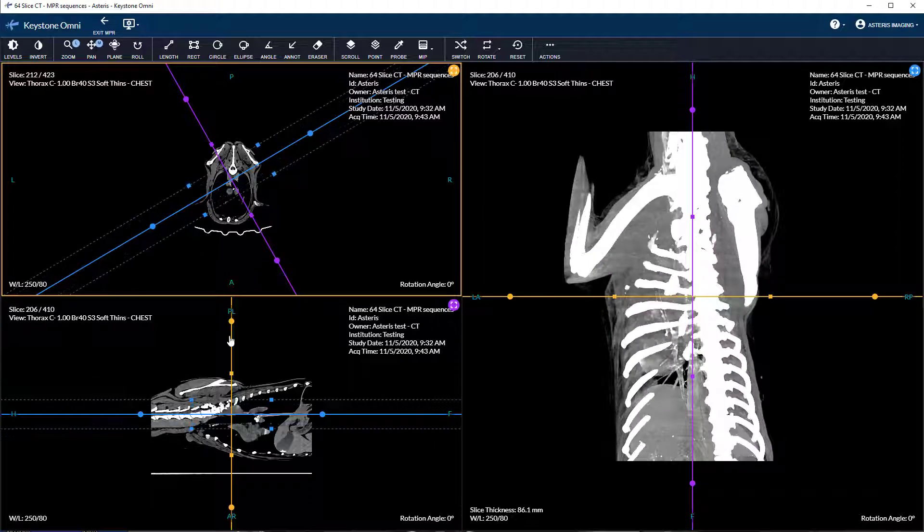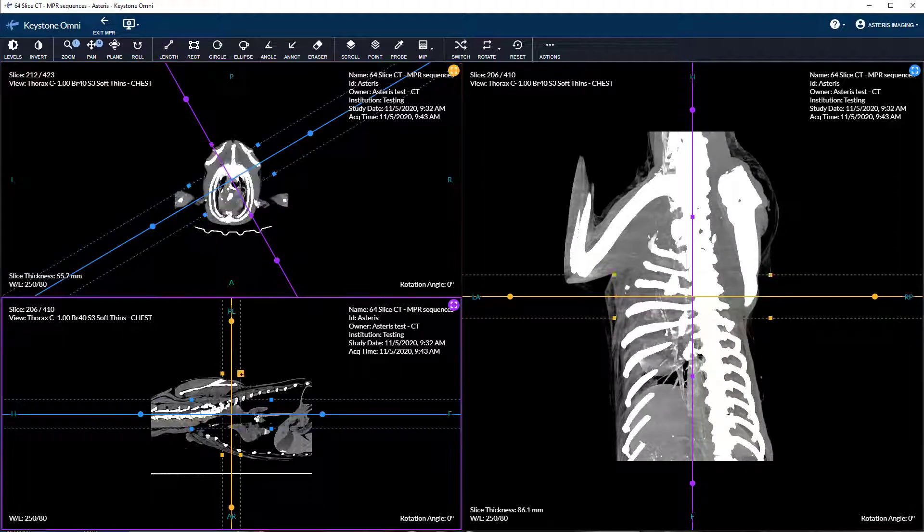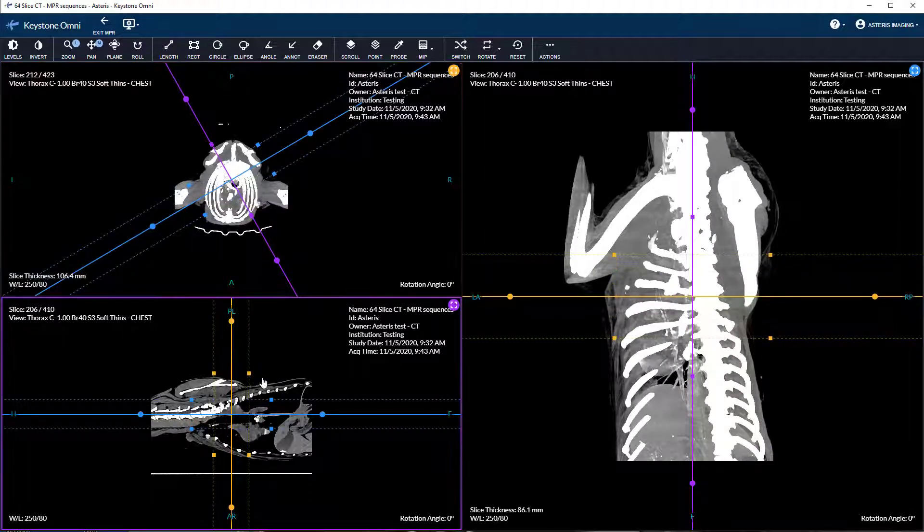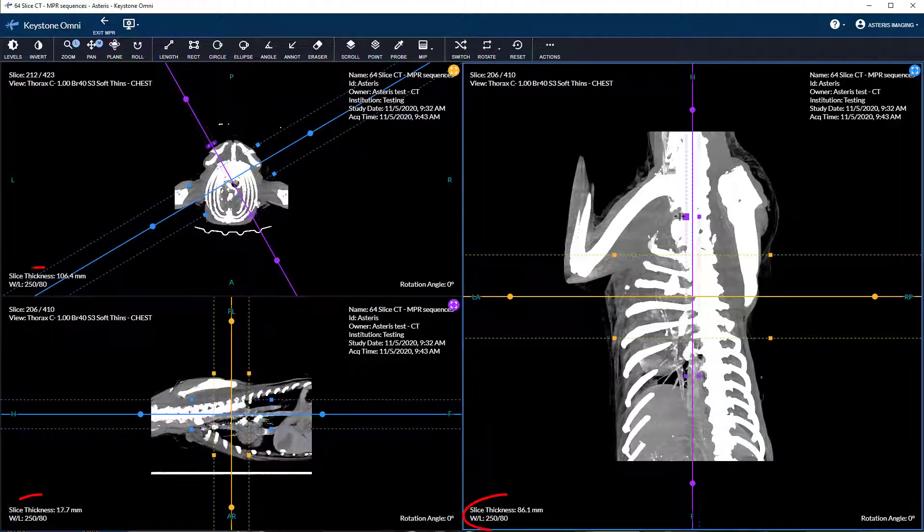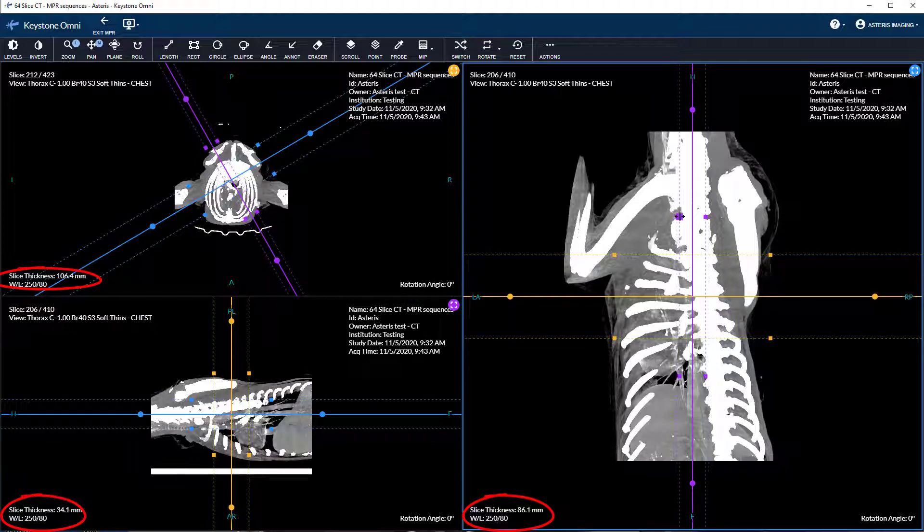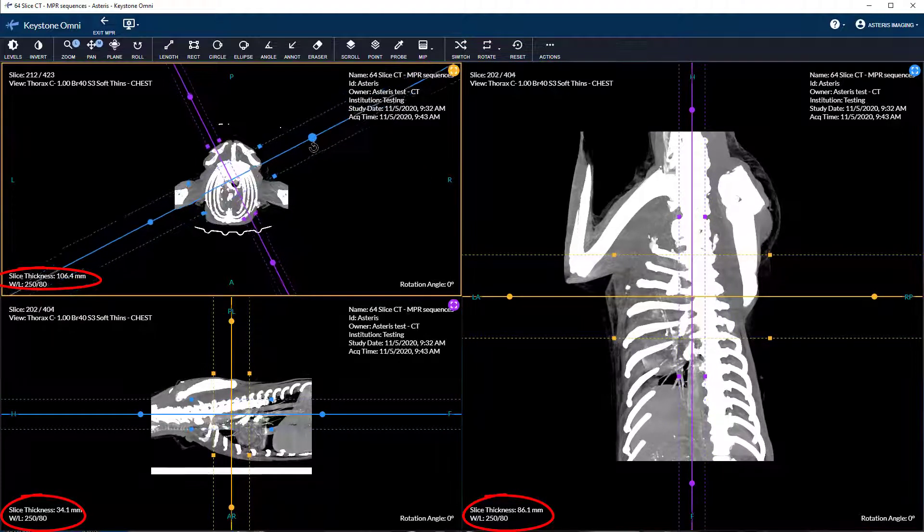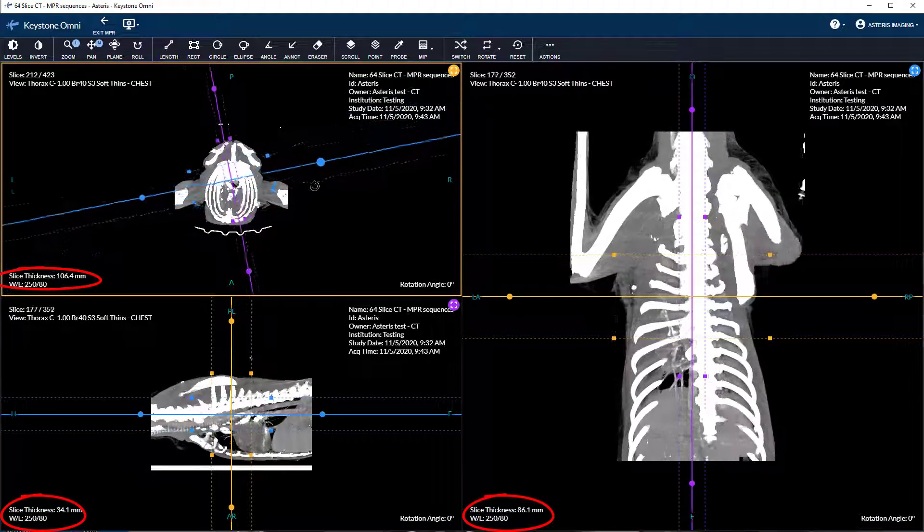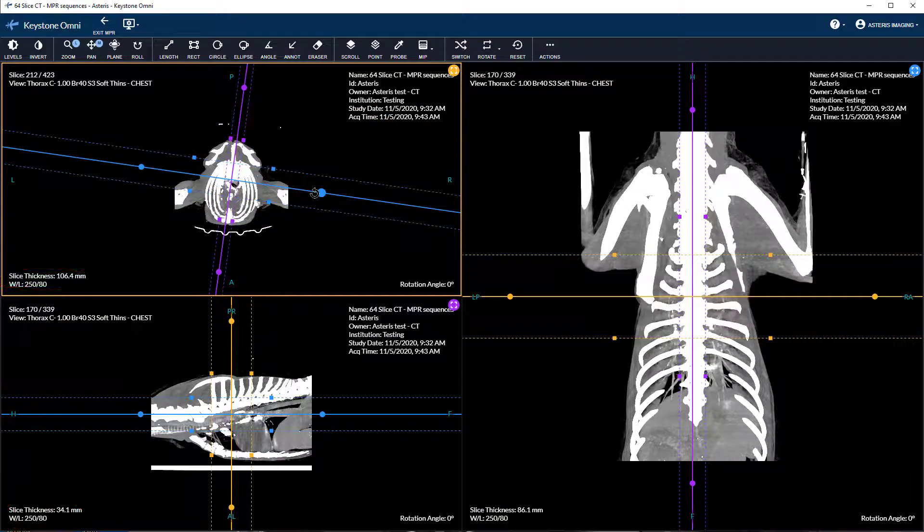To adjust slice thickness, drag the square handles respectively. The expanded volume will display the thickness amount in millimeters at the bottom left of the individual panes.